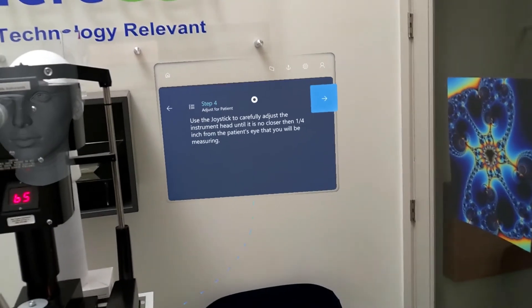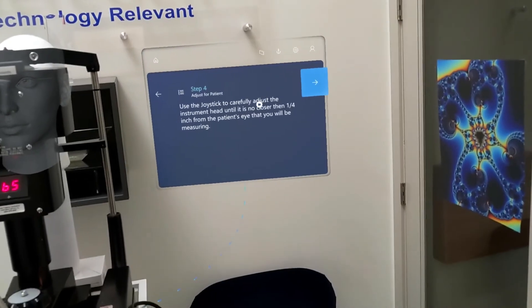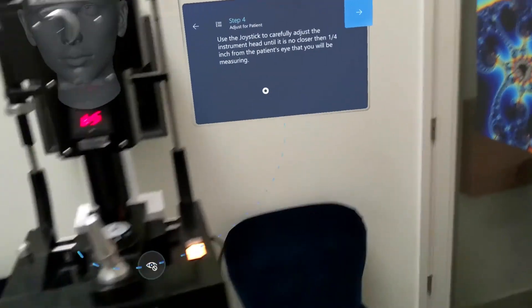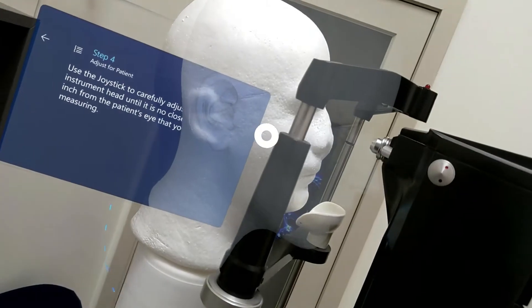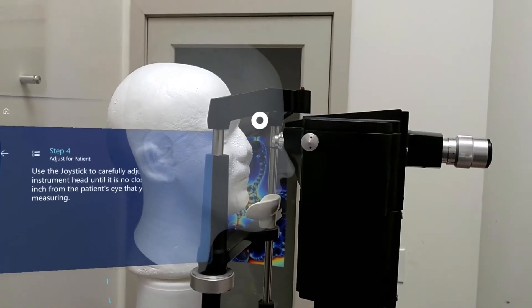Use the joystick to carefully adjust the instrument head until it's no closer than one quarter of an inch from the patient's eyes that you'll be measuring. Take this joystick and we would be moving right there.